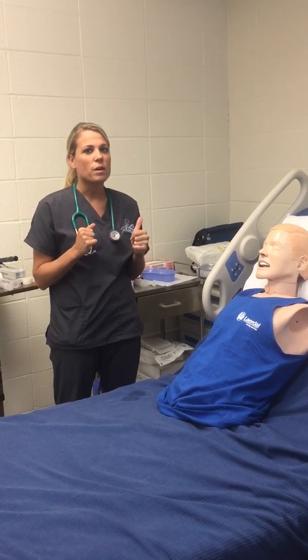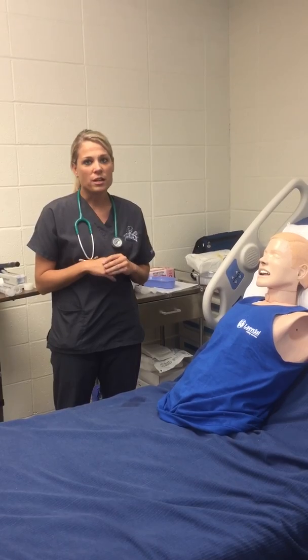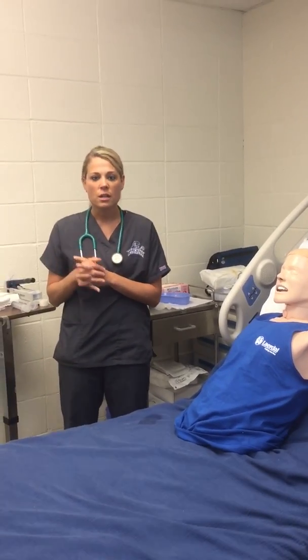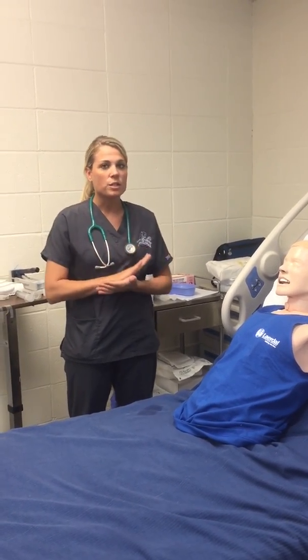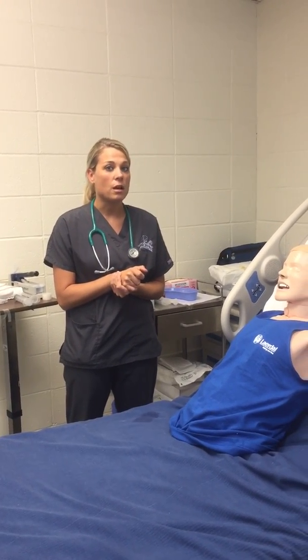go to the patient's room, introduce myself, and identify the patient with 2 patient identifiers. I would provide privacy. I would do hand hygiene, and I would explain to the patient what we will be doing and why it is necessary, and how the patient can cooperate during the procedure.